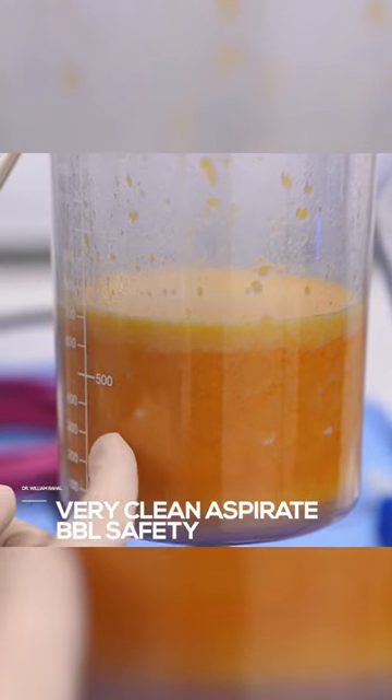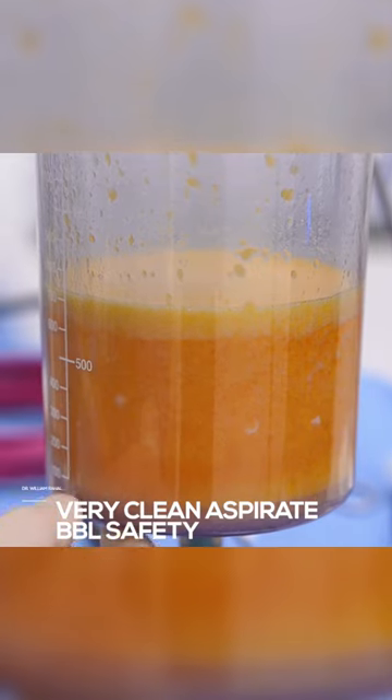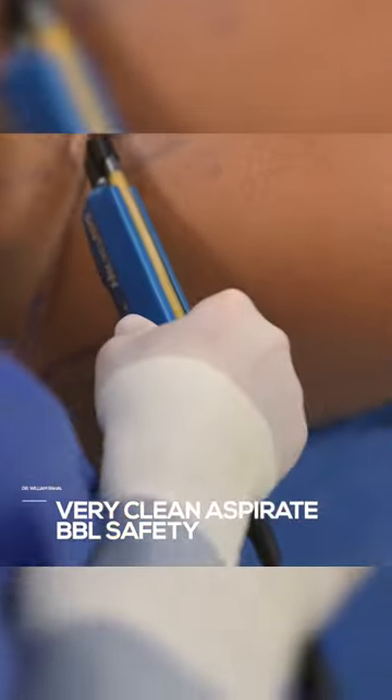So this is very clean aspirate. It's all yellow, all fat, with a little bit of tumescent fluid on the bottom. When you're removing fat, it's important that the quality be very clean, especially with high volume.